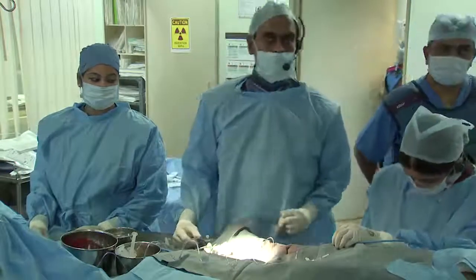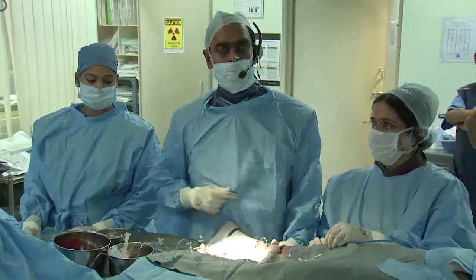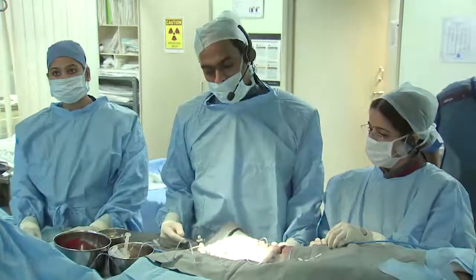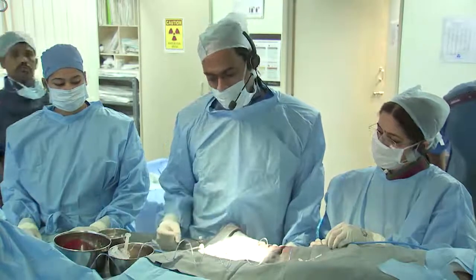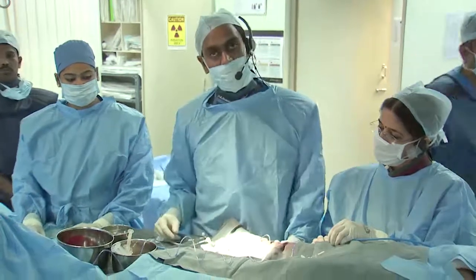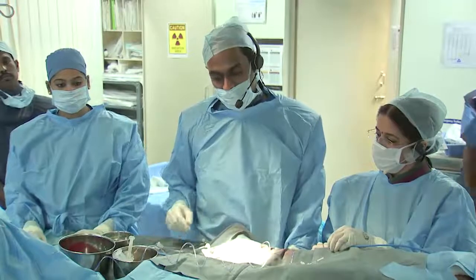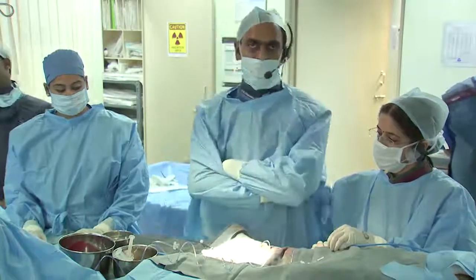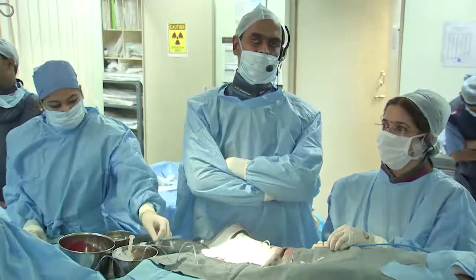Yeah. So what we debated was whether to use a 4 or a 6 or something in between. The experience with a 4 mm device, even for that matter a 6 mm device, Dr. Joseph Vettukatil has observed thrombosis at the end of 3 to 4 months. As Dr. Locke was mentioning, if it is a 4 and if the patient gets into trouble, it is always easier to put in a stent and try to open it out.